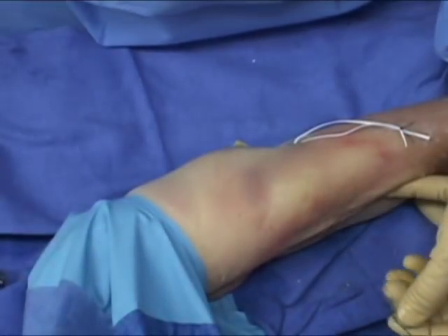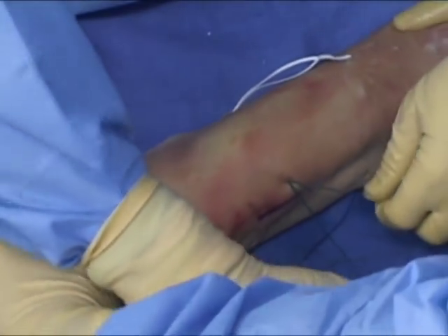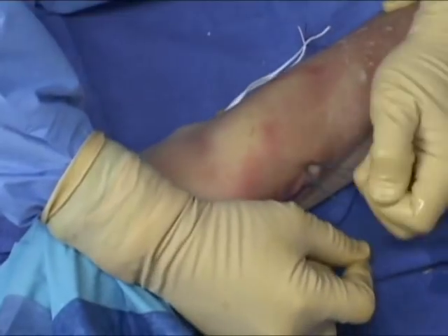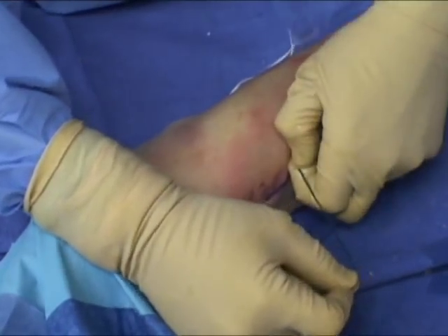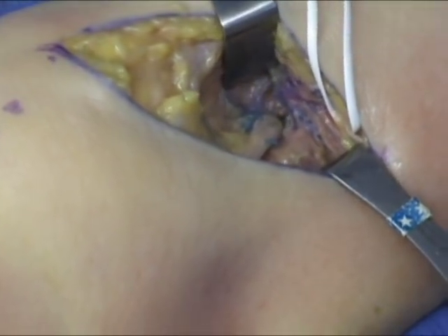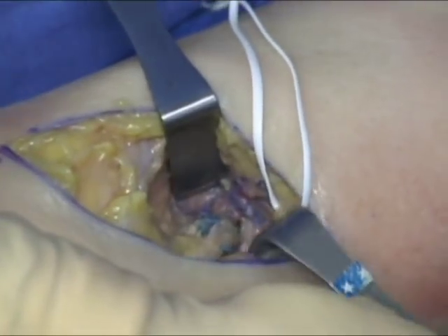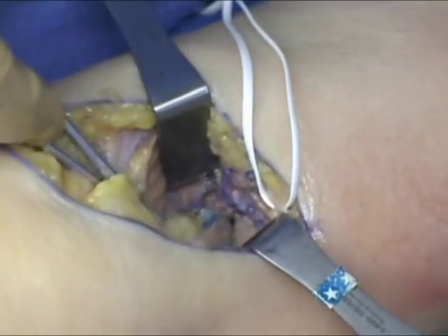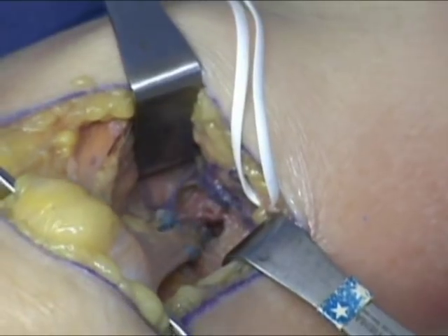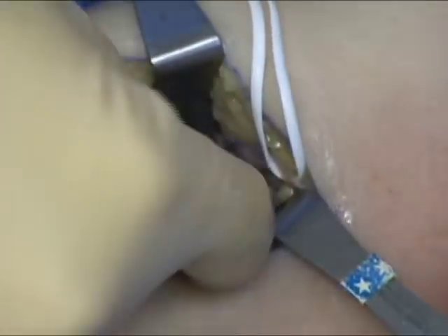Traction on the loop sutures draws the biceps tendon down towards the biceps tuberosity, and the assistant helps guide the tendon into the 8 mm anterior hole. The endobutton is drawn through the posterior hole, and toggling is performed to ensure that it is free on the far side of the radius. Brisk tension on one of the two marionette sutures toggles the endobutton into position. Release of tension ensures that the endobutton lays flat on the posterior cortex. Anterior inspection confirms that the biceps tendon has been delivered into the anterior hole, advanced sufficiently to ensure adequate contact with the anterior periosteal surface of the radius so that healing will occur. Tension on the biceps tendon at this point easily flexes and supinates the elbow.